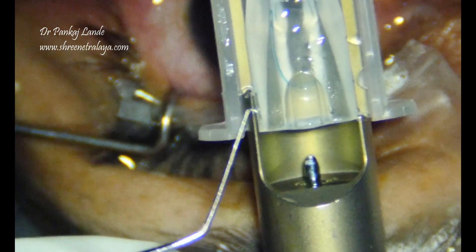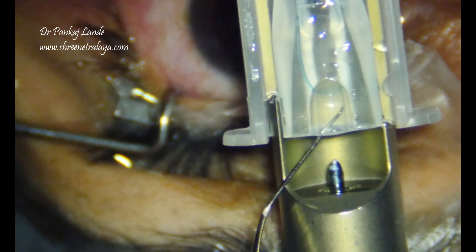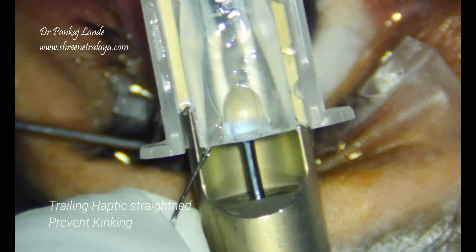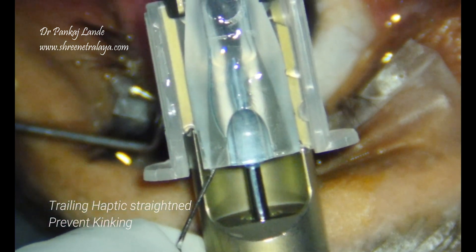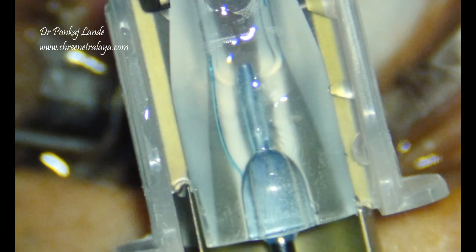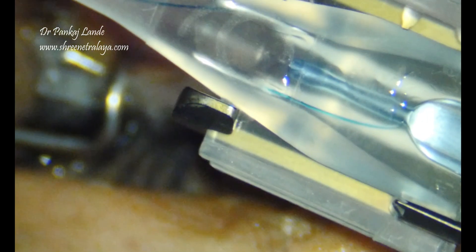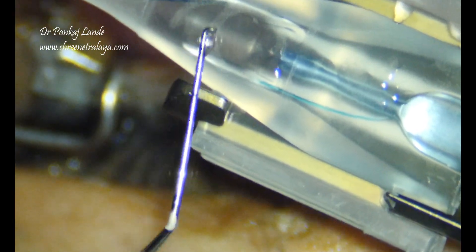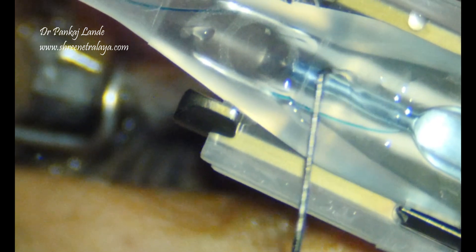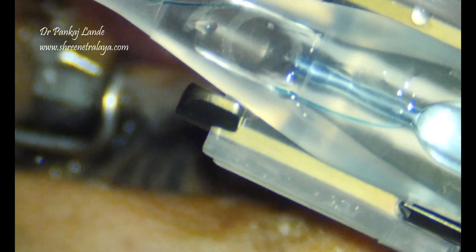The trailing haptic is taken to the side with the help of a Sinski hook and the optic is engaged so that we can push it comfortably with the pusher. This particular position is very much required — both haptics are straight without any kinking, and the optic is engaged with the injector cartridge.